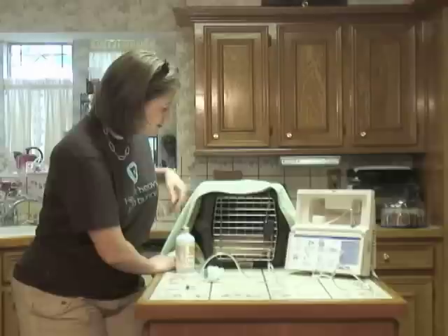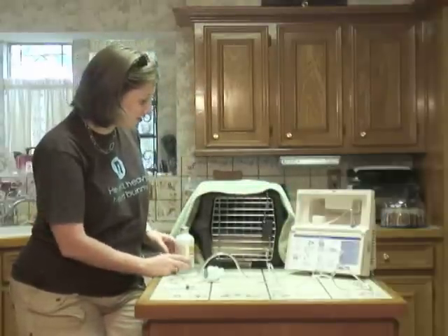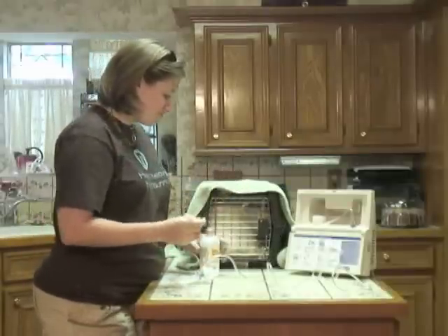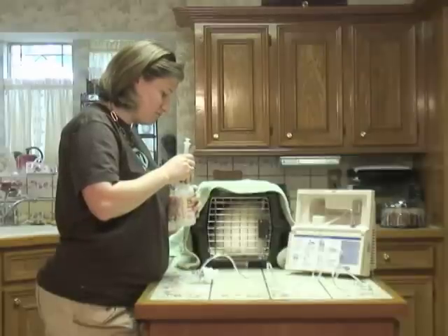We close it like that and that kind of creates the chamber that we're needing. Now that she's in and all enclosed, we're going to go ahead and put our medicine in the cup like we did before.